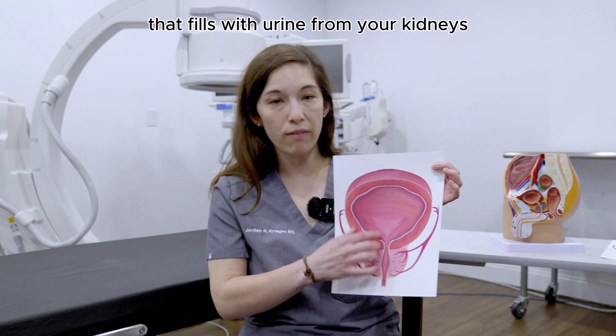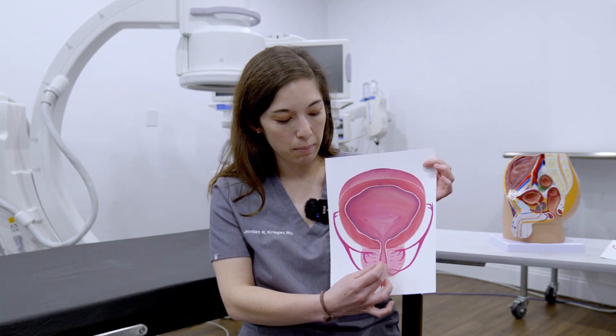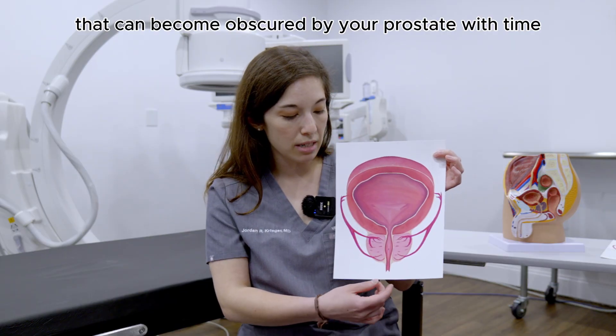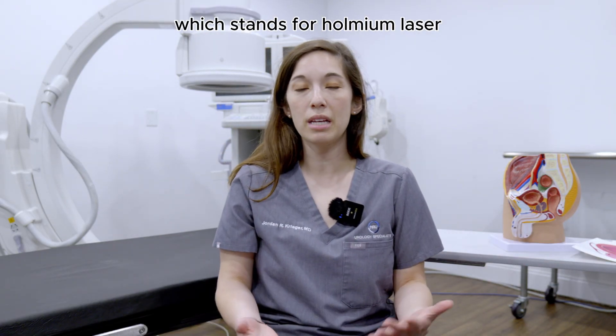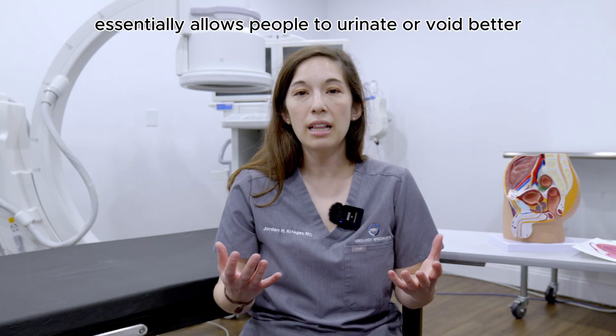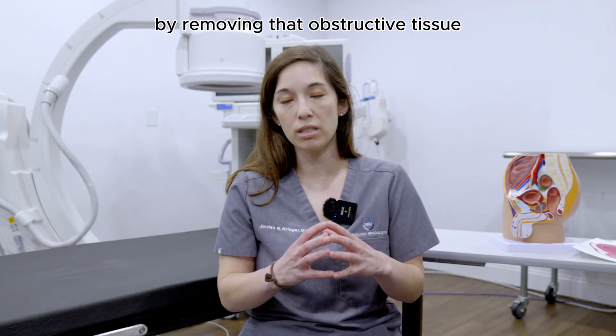You have a bladder here that fills with urine from your kidneys, and then you pee through this channel that can become obscured by your prostate with time. The HOLEP procedure, which stands for Holmium Laser Enucleation of the Prostate, essentially allows people to urinate or void better by removing that obstructive tissue.